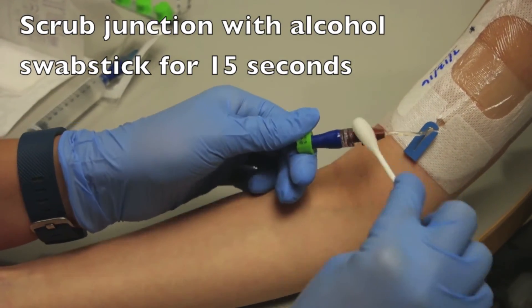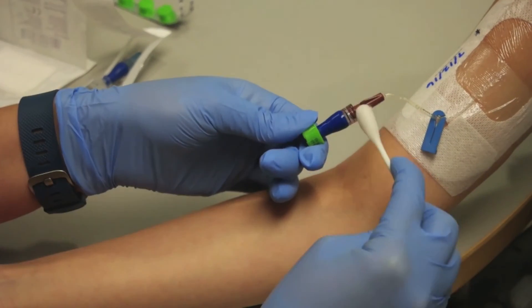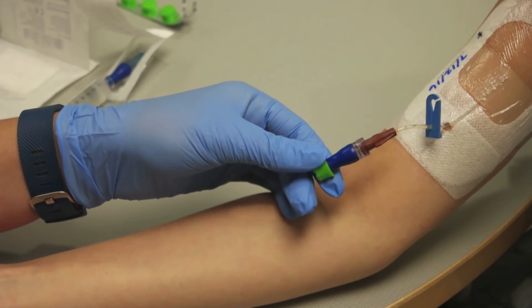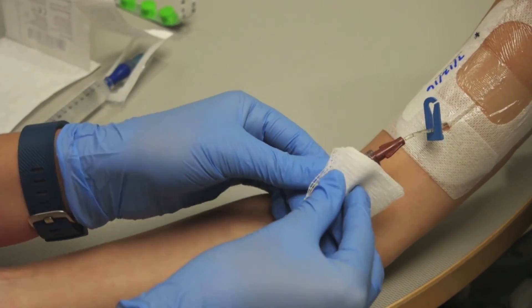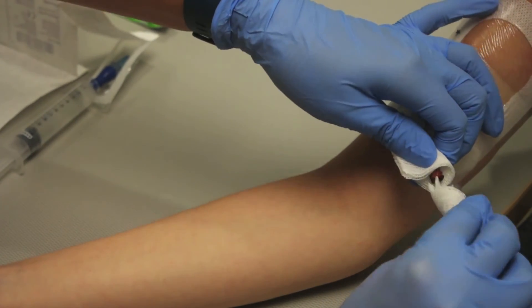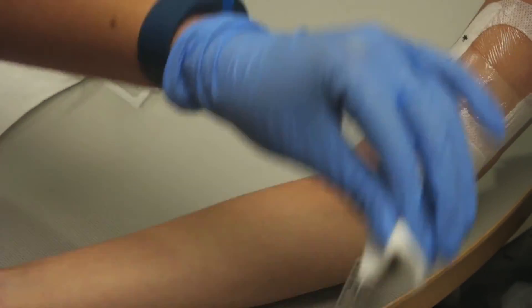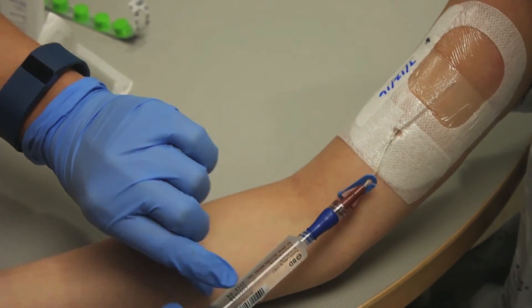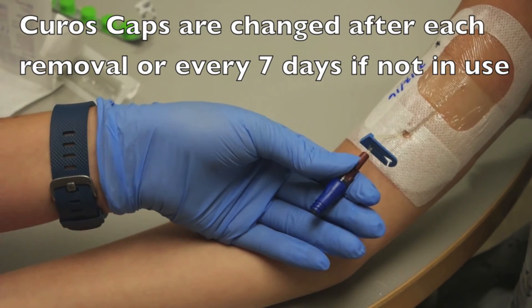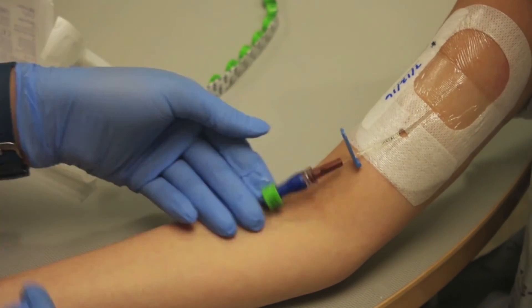Extend the cleansed area approximately 1 inch on either side of the junction. Now clamp the line and with sterile gauze wrapped around both sides of the junction, remove the CVC cap from the hub. Connect the hub to the new primed cap or IV tubing. Unclamp, flush, and then apply new Kuros cap. Remove gloves and perform hand hygiene.